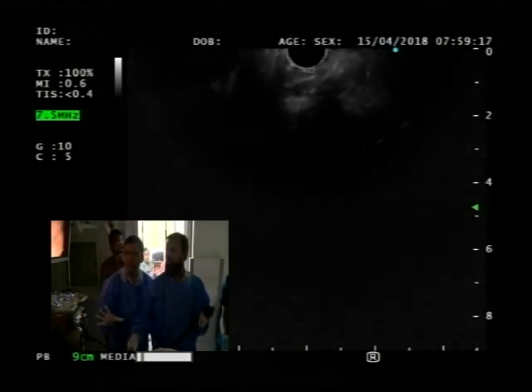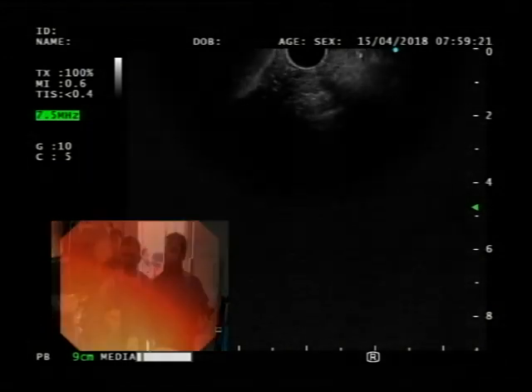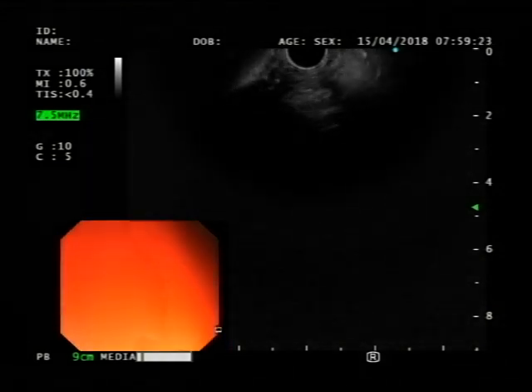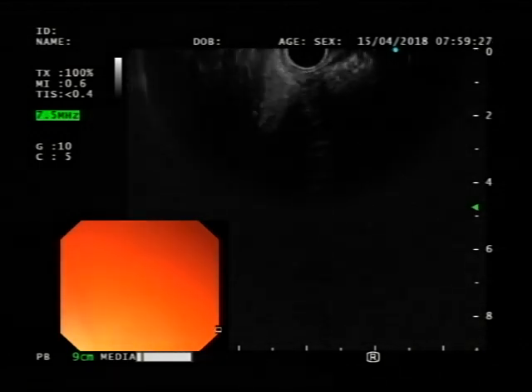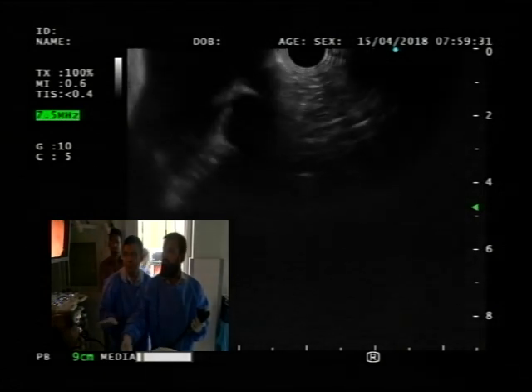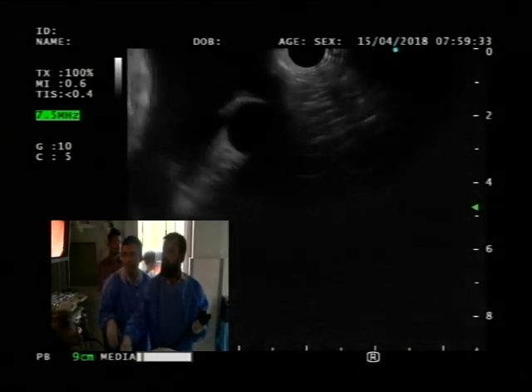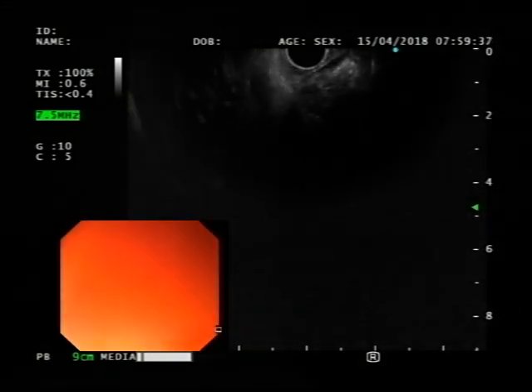Needs to go very smoothly. There should not be much resistance. It's going to be just like going very smoothly. I think maybe there is too much wheel movement there. It should be moving very smoothly. Try again, start over.